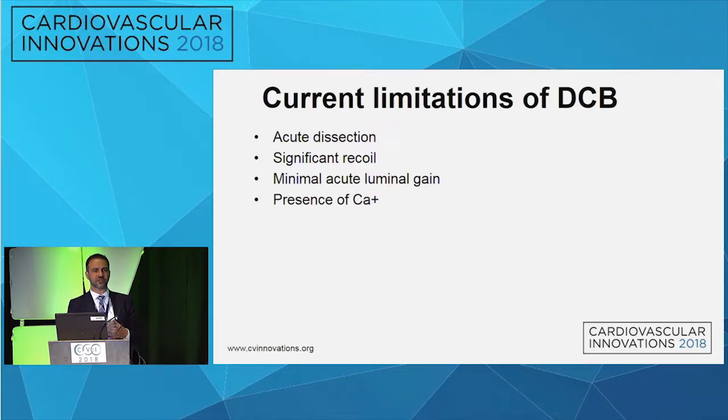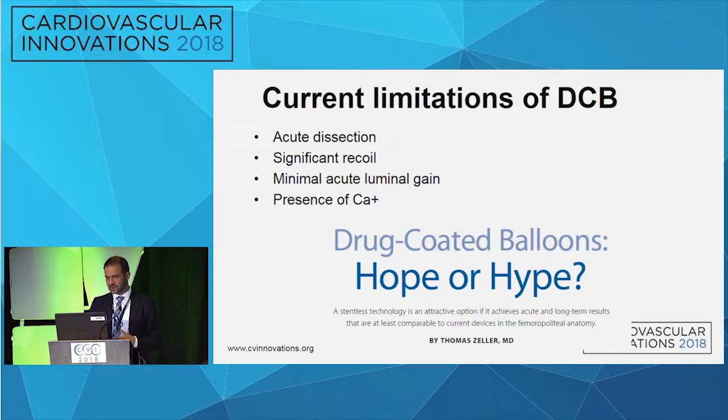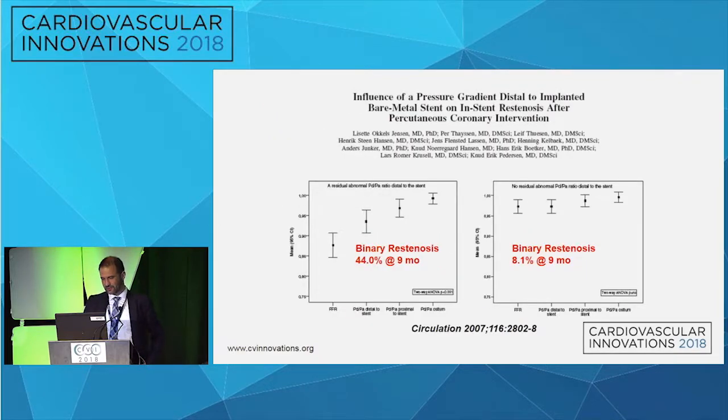We are dealing with patients. We are dealing with people's ability to walk and not have pain or heal their wounds. And we need to understand that DCB, while it has really made a change in the way we practice, has limitations, as I have outlined here. And this is Dr. Thomas Zeller. I think you wrote this a few years ago, Thomas, maybe 6-7 years ago, where you said hope and/or hype. I think it's been more hope, I hope, in the way that we have treated these patients, no pun intended.